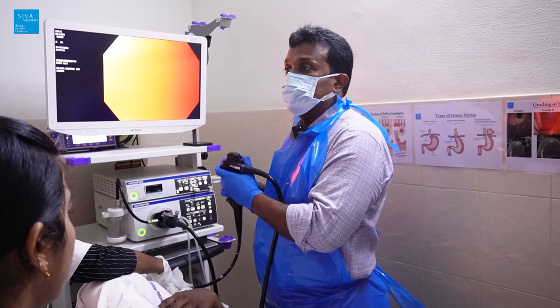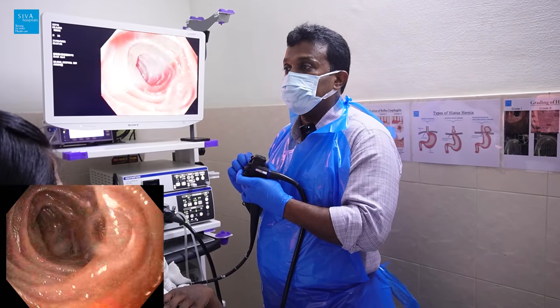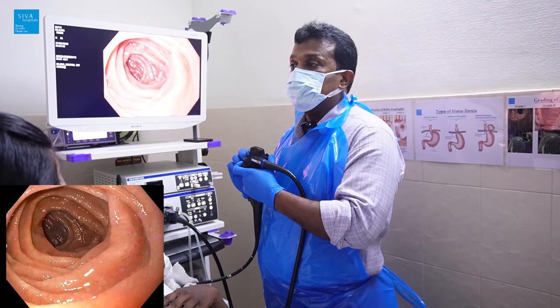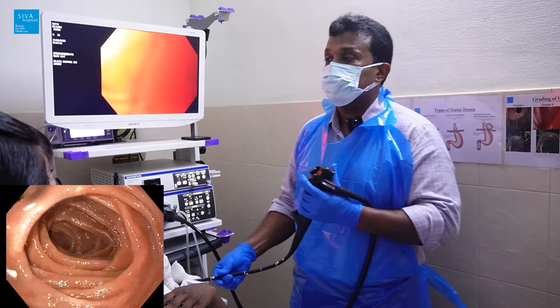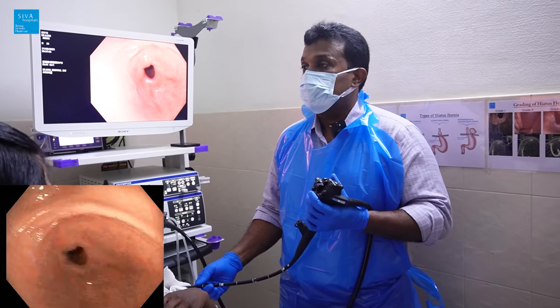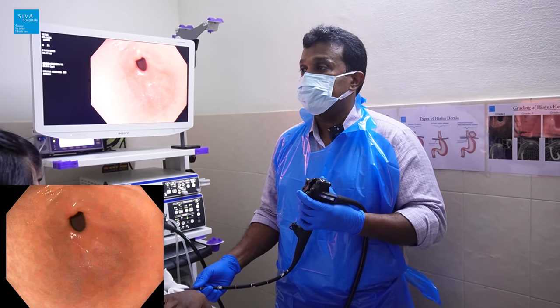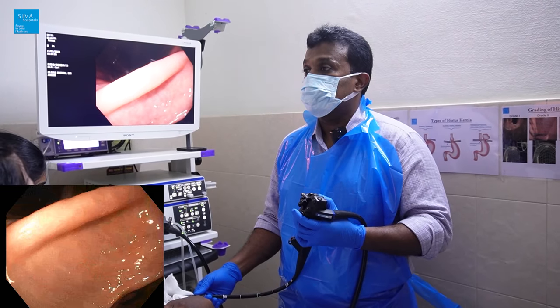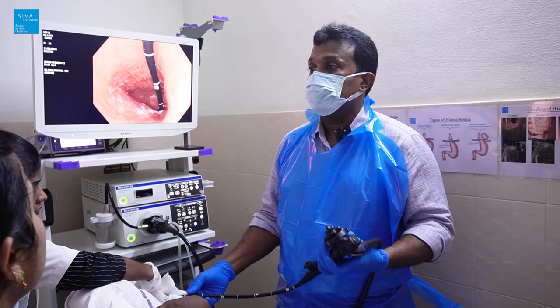Now entering the second part of the duodenum — the second part looks normal. The antrum appears inflamed. This is the incisura of the stomach; I'm going to perform a J-maneuver now.